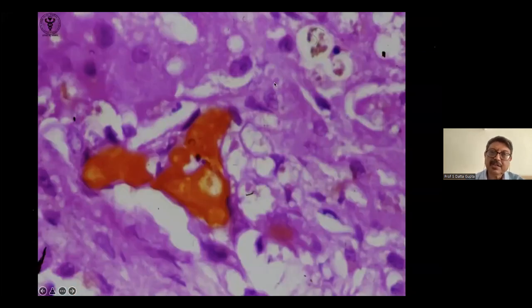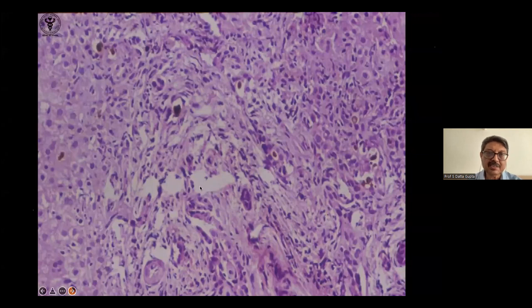Now, I talked about canalicular cholestasis. The canals of Hering are generally not seen. This is at the junction of the portal tract and the last layer of hepatocytes. Cholestasis within the canals of Hering, if you see, especially like this yellowish bile, is a sign of septicemia. So you can see it.